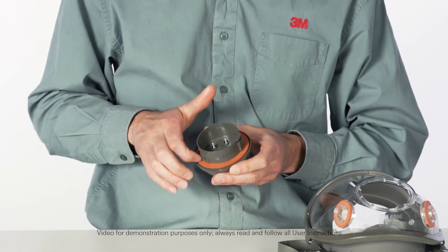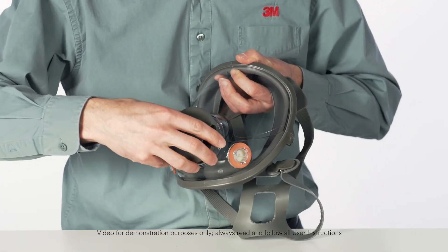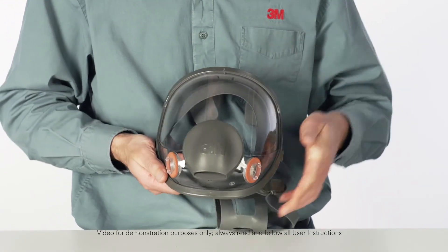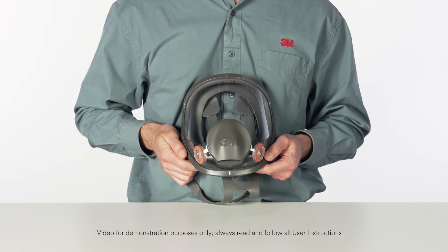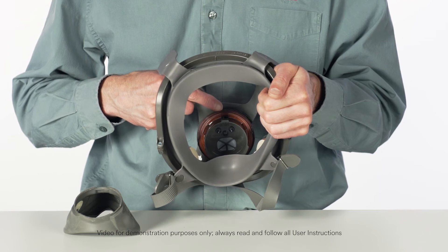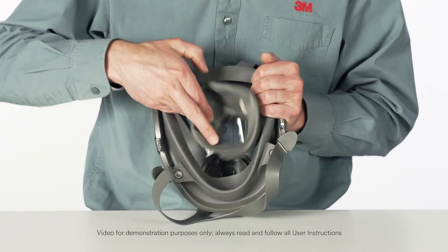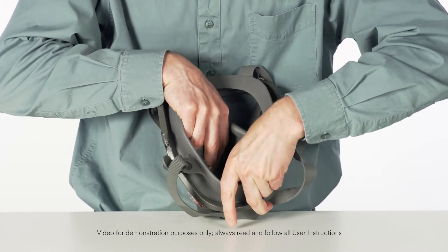Install the new center adapter gasket, aligning the notches in the center port of the facepiece lens. Slide the adapter into the lens port and twist it clockwise one quarter turn to stop. Be certain that the center adapter gasket is properly in place and sealed and that the adapter assembly is fully engaged. Position the nose cup assembly onto the center adapter, aligning arrows.